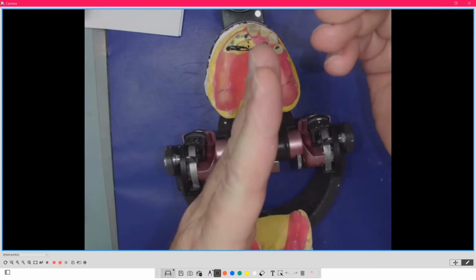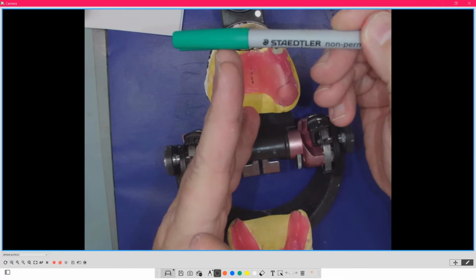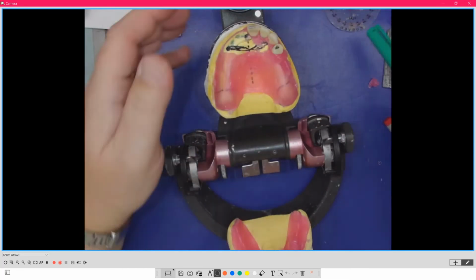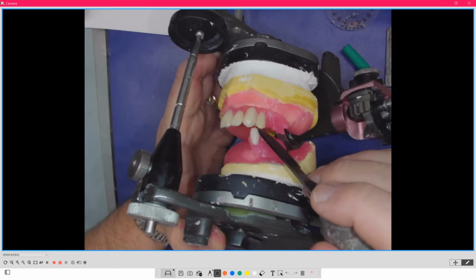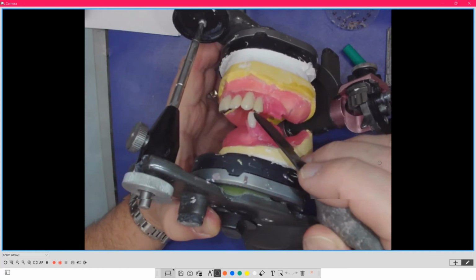So all I've done is I've just skirted the tooth over a little bit, and I haven't even cut anything yet. But I can do that because I have the freedom aspect built within the teeth. So then that lets me do that. Now what that did was that increased the overbite or the overjet of the tooth a little bit, okay?